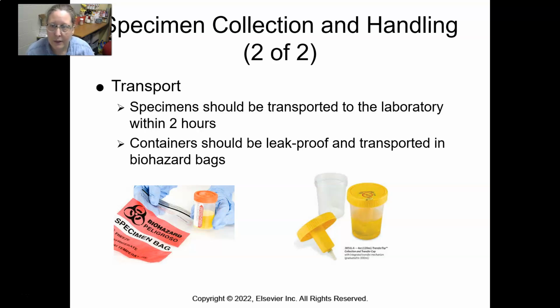That is ideal. So really right away, you don't want to set them down because then you might forget about them, and you definitely don't want them sitting in a nursing station for an entire shift or a day, because then the specimen is no good. This is especially important for specimens that are difficult to collect, like pericardial fluid or pleural fluid or spinal fluid, and surgical specimens and things like that.